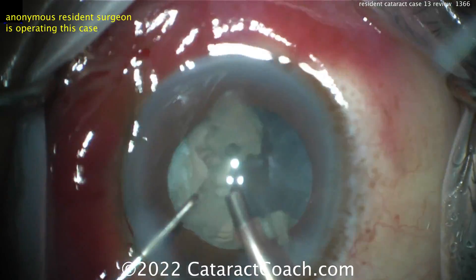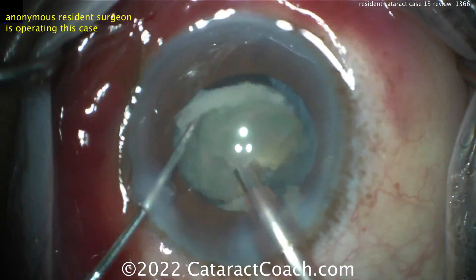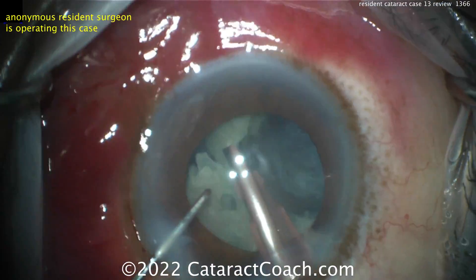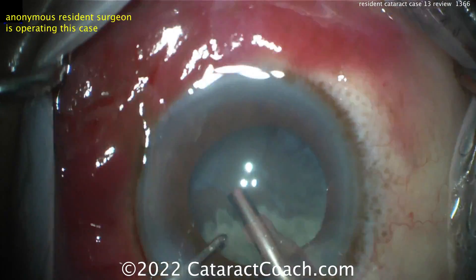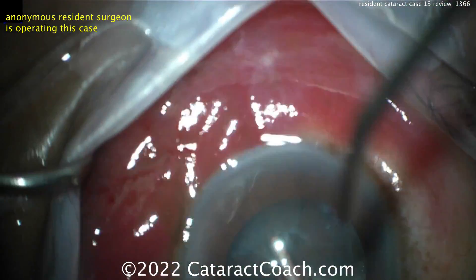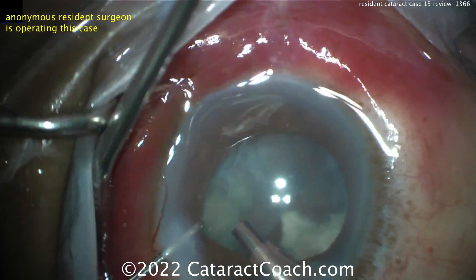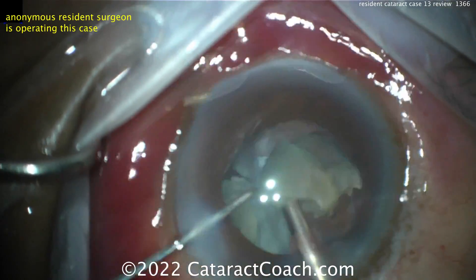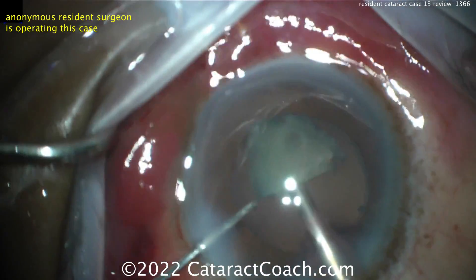Look at the chop — sub-chopping the pieces, taking those down. The eye stays in primary pretty much the whole case. This is a good case — I like it. So if you're a resident watching this, do not expect to have this level of performance at case 13. It's certainly not a U.S. resident, because we don't do a whole lot of manual small incision surgery before getting into phaco — most programs go right into phaco.